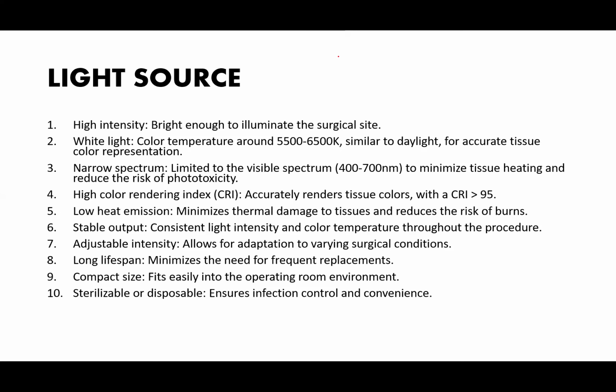Now, it should have a narrow spectrum, okay? Limited to the visible spectrum, like 400 to 700 nanometers, to minimize tissue heating and reduce risk of phototoxicity.